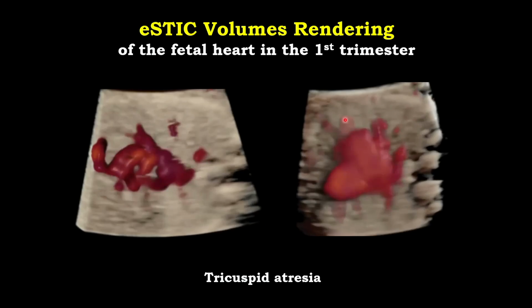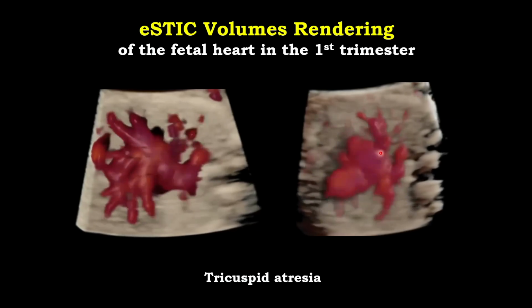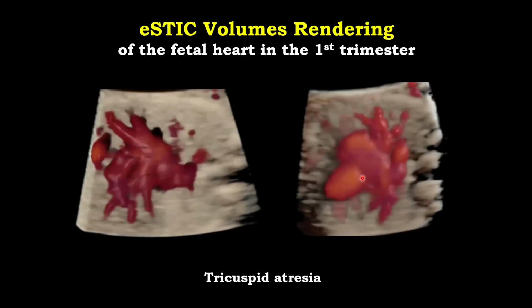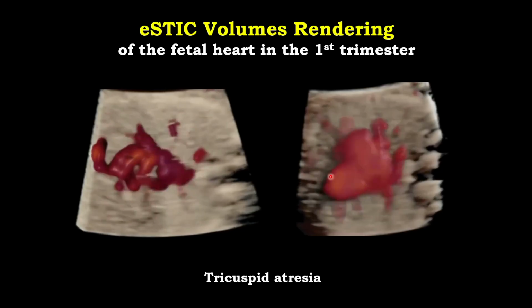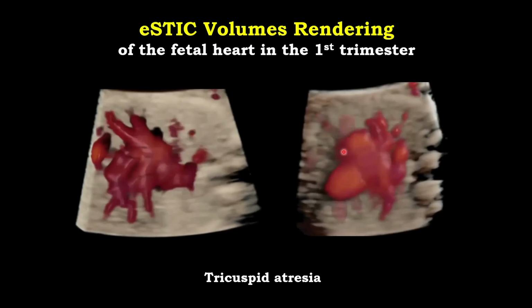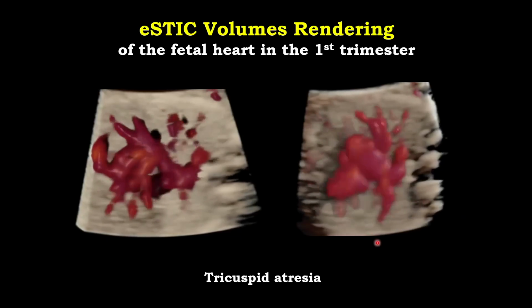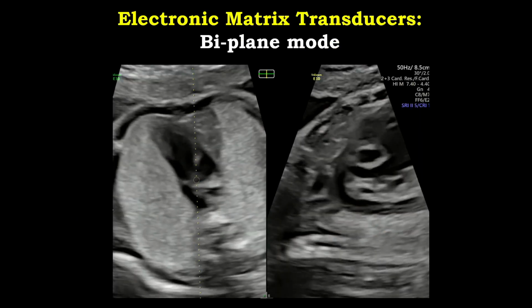Going to the chest, we can clearly visualize 3 chambers in the heart. This is the right atrium, the left atrium. Please note that we can clearly see the normal drainage of the pulmonary veins to that left atrium, the AV valve, the left ventricle, and the right ventricle is missing. This is because it's tricuspid atresia. The right ventricle is very, very small. You can see the VSD and the blood flow through it. So these are all the anatomical landmarks right in front of you, and again, this is an easy diagnosis to make when you deal with these images.